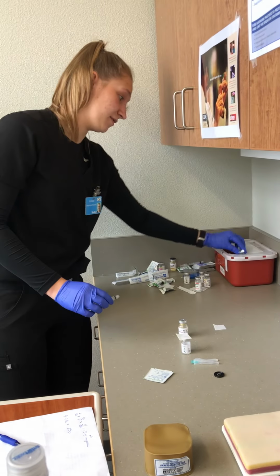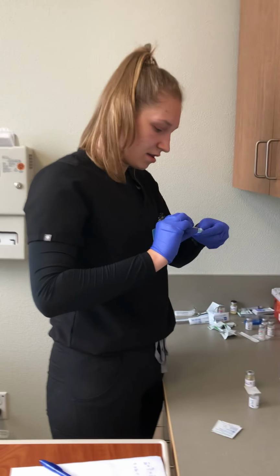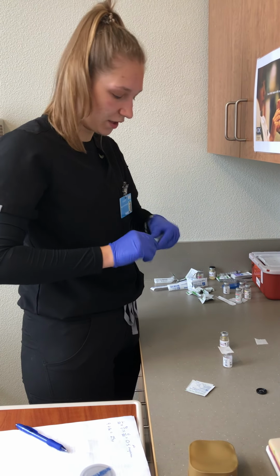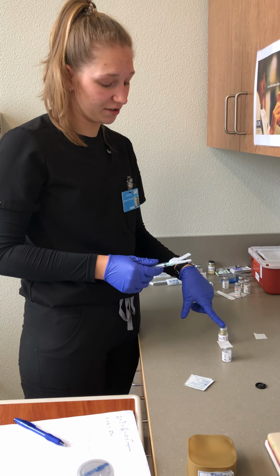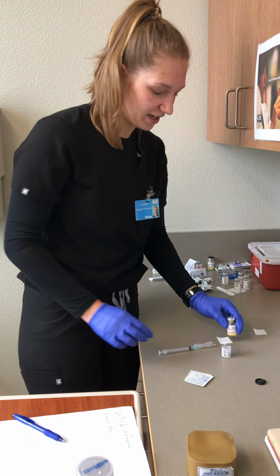I'll put it in this safety box. I'm going to twist on my new needle. Okay. In reality, I would not have actually done that. I would have kept my filter needle on until I drew this up, and then I would have switched it when I had this drawn up, but I did that wrong.